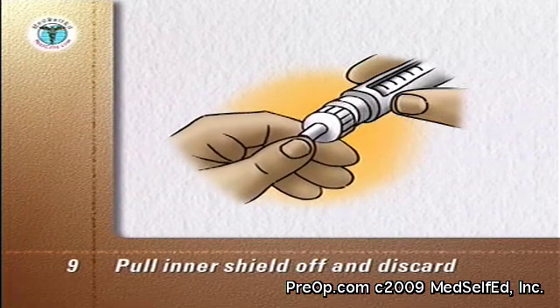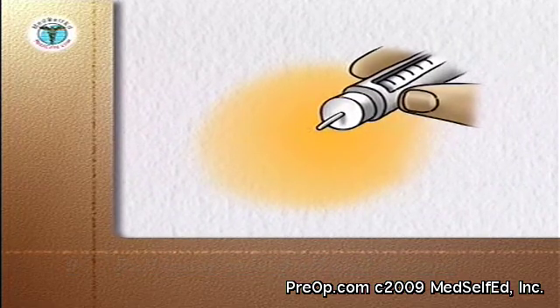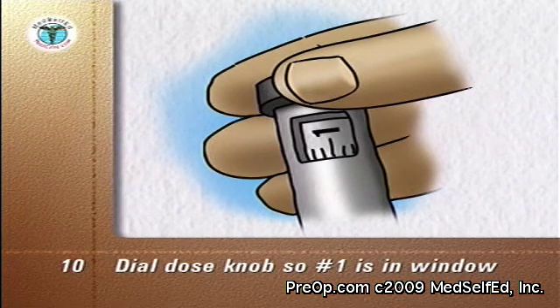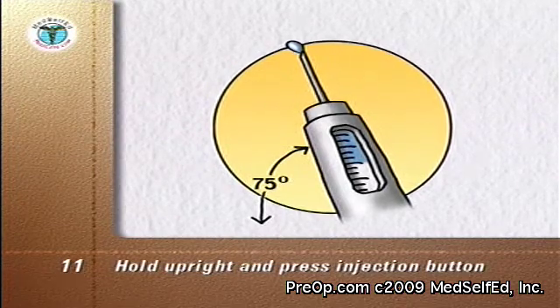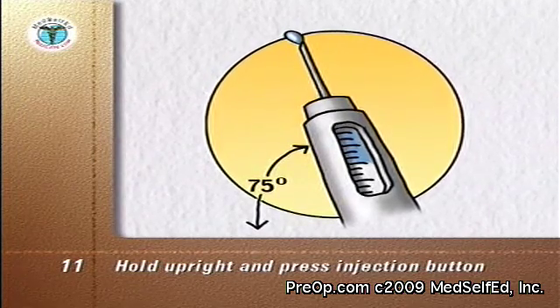Hold the pen upright and tap the cartridge holder to enable air bubbles to escape through the needle. Dial the dose knob so that number one is in the dose scale window, and prime the pen according to the manufacturer's instructions. Hold the needle upright, press in the injection button at the end of the unit, and check that insulin comes out of the tip of the needle. If no insulin is seen, continue to dial up one unit at a time and press the injection button until insulin is seen. A new cartridge may take four to six units before insulin flows.